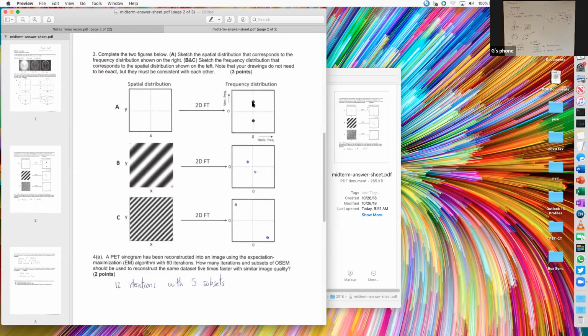In that case, we have vertical frequency information. The signal is essentially focused in those two points of the spectrum, so it's a pure frequency signal, which means it's a pure sine wave type signal. And because it is along that axis here, I'm going to try to annotate that just to make it clear. So basically it's going to be a pattern of vertical stripes like this, and the spacing of the stripes is going to depend on the actual frequency that's in the spectrum.